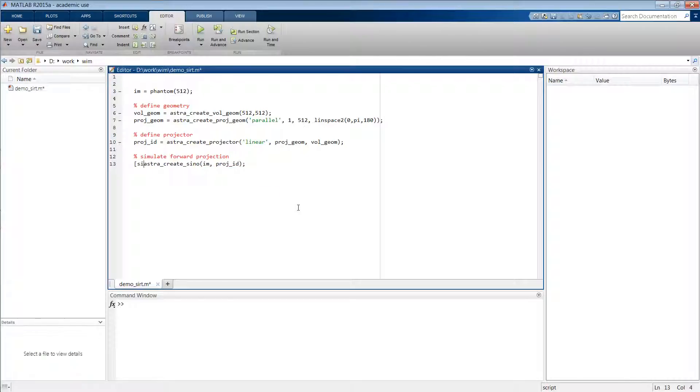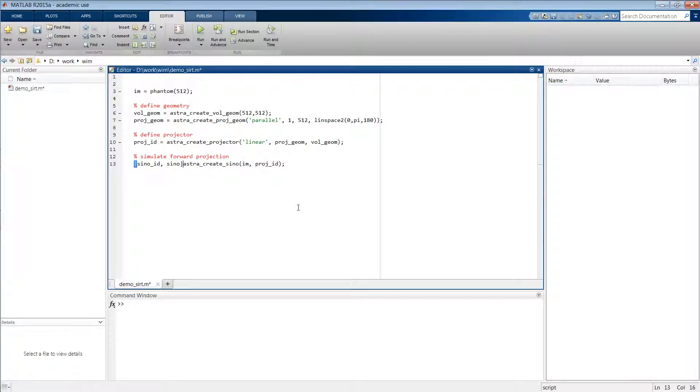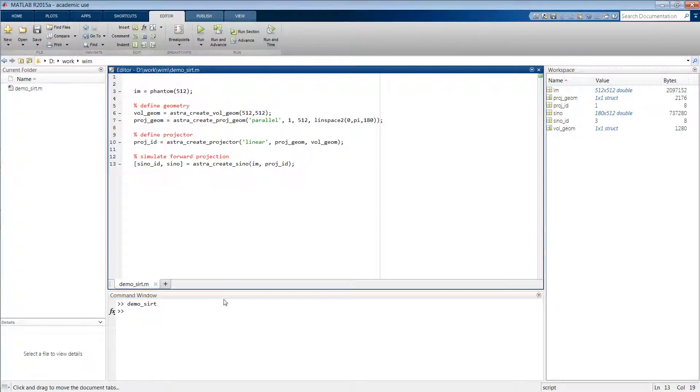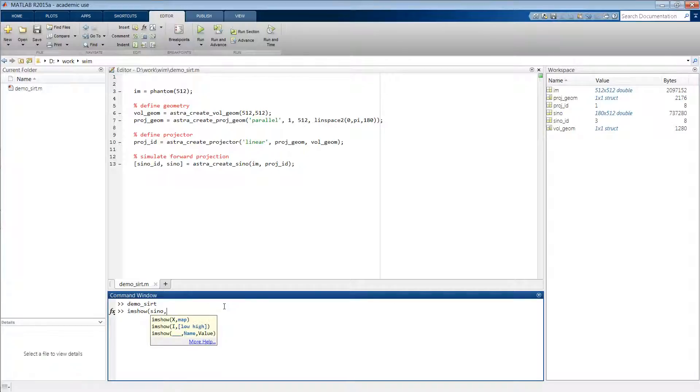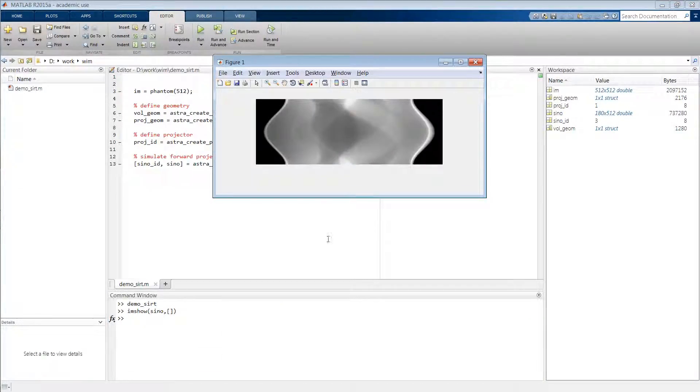This then returns an identifier to a data object that stores the sinogram, and if you specify a second output parameter it stores the sinogram itself. So if we now run this script and show the sinogram, we get indeed the projection data of our original Shepp-Logan phantom.